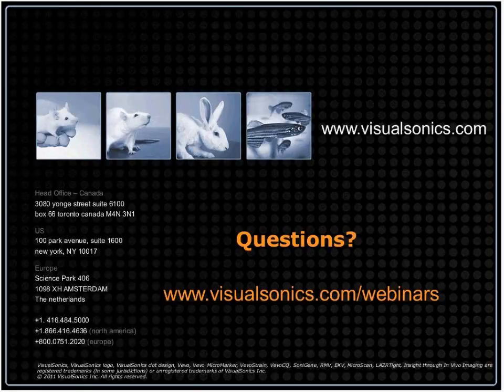Okay, Stephen, thanks. That's great. Stephen, just another question about short cine loop lengths. You mentioned that if the cine loop is less than 20 seconds, the software prompts you. The question here from one of the listeners here today is, why do you recommend 20 seconds, and what might happen if it is shorter?